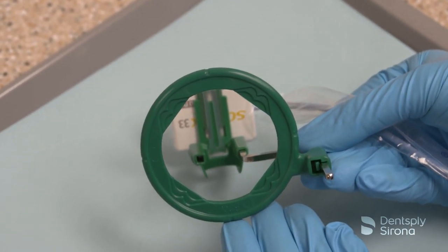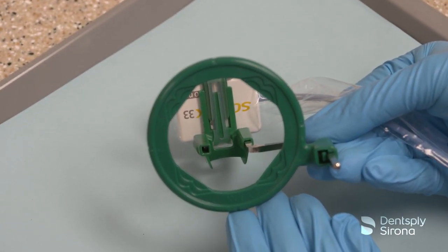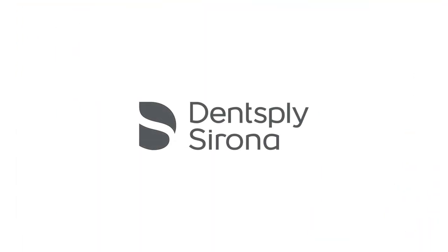Ensure that the image receptor is visible through the green aiming ring. Thank you for viewing this instructional educational video brought to you by Dentsply Sirona.